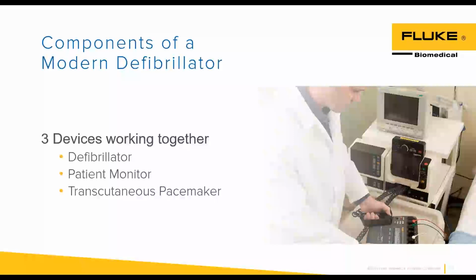And then another feature that gets overlooked a lot is CPR pressure and rate monitors. You might see these new pads, and on that pad, it has a place where you're going to put your hands. It's going to show you right where to put your hands, and it's going to tell you if you're depressing deep enough into the patient to perform good CPR.